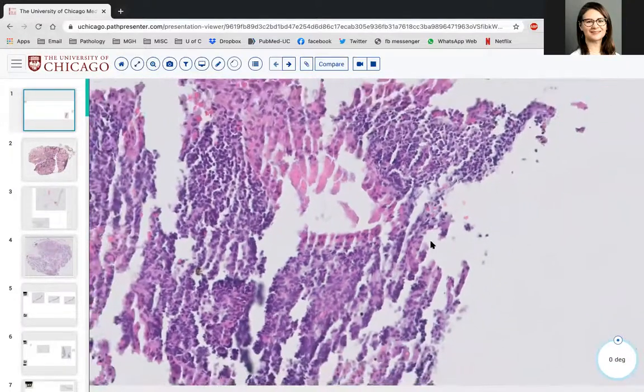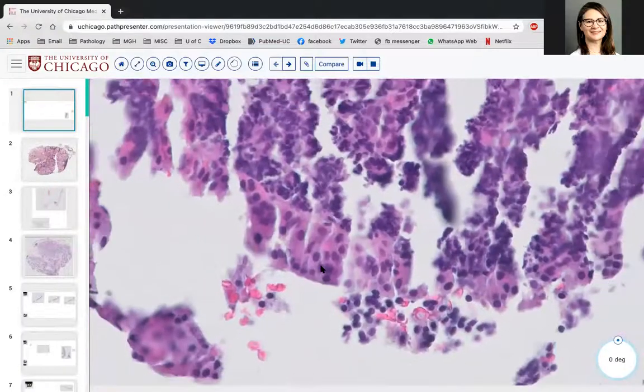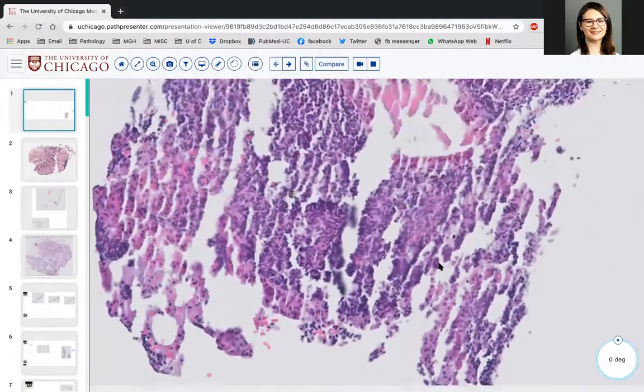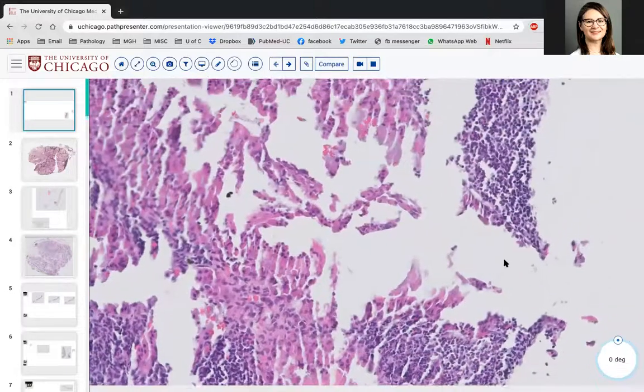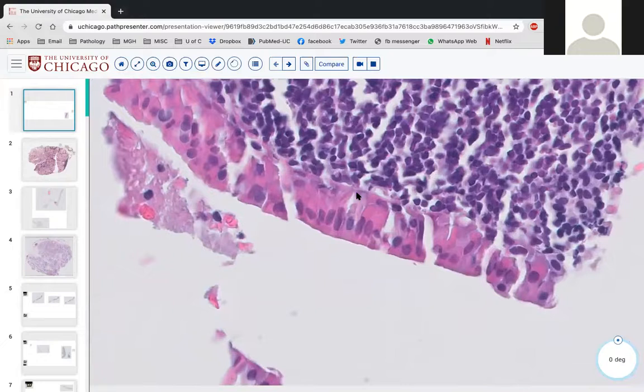Yeah, there are certain cases like this where a diagnosis is totally possible on core biopsy, and this is one of them. Sorry about the quality, I think this might have been a consult recut or something, so it's a little bit poor quality, but what's your thought? So these features in the history are very consistent with a Warthin tumor.